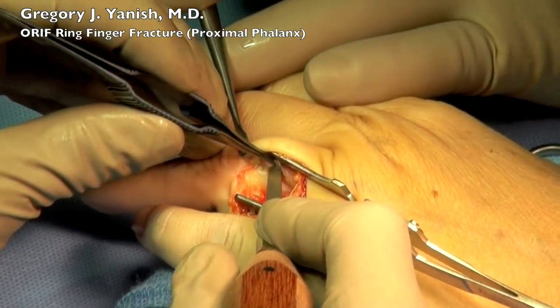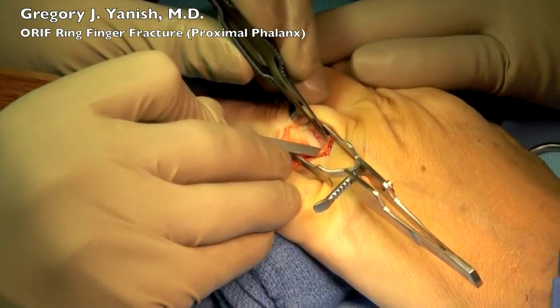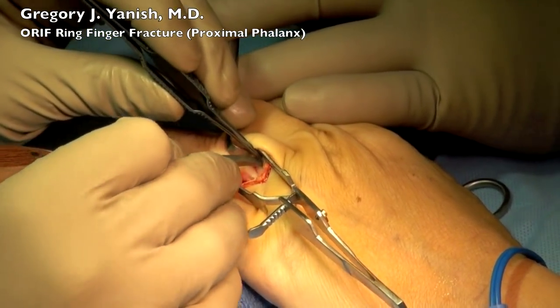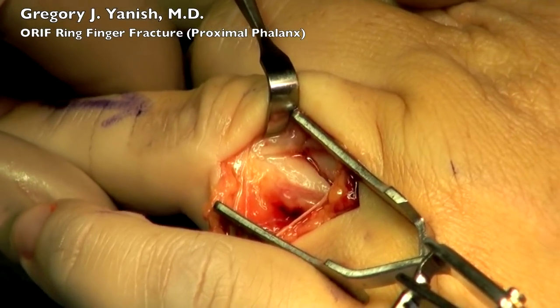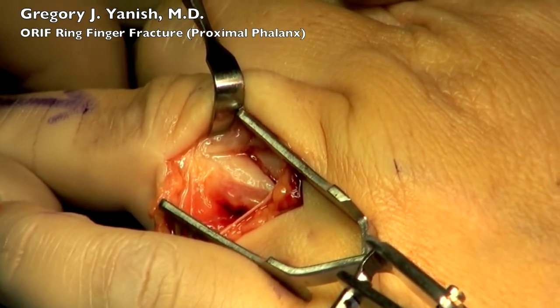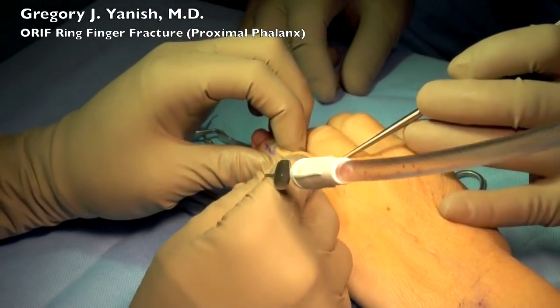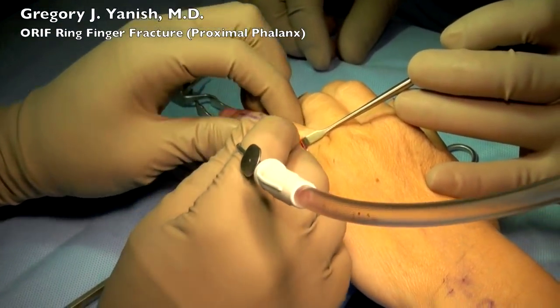The extensor tendon has been retracted and now we're visualizing the periosteum of the bone, which has been incised gently. I'm using a small key elevator to elevate the periosteum off of the fracture site, being very careful to minimize the periosteal elevation. This is the blood supply to the bone and we want as much of this to remain as possible. You can see the fracture line there. I'll use some suction to try to get out some of the blood clot and fibrin tissue that's been deposited there since the patient's initial injury.